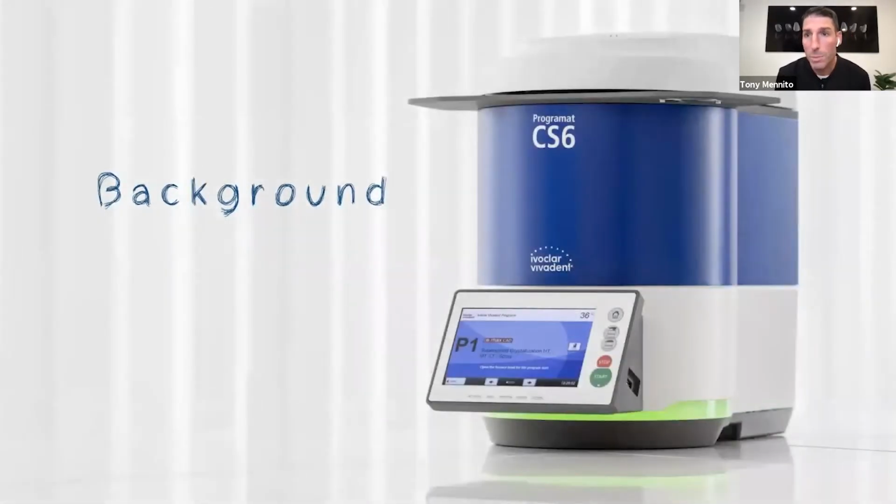And then the last piece of the puzzle when it comes to CAD/CAM systems is an oven of some sort. And this is Ivoclar's brand new CS6, and this is a game changer as far as post-processing goes. So for glass ceramics and zirconia, those tend to need a little bit of post-processing in order to get them to their final strength, their final color, their final finish, basically.